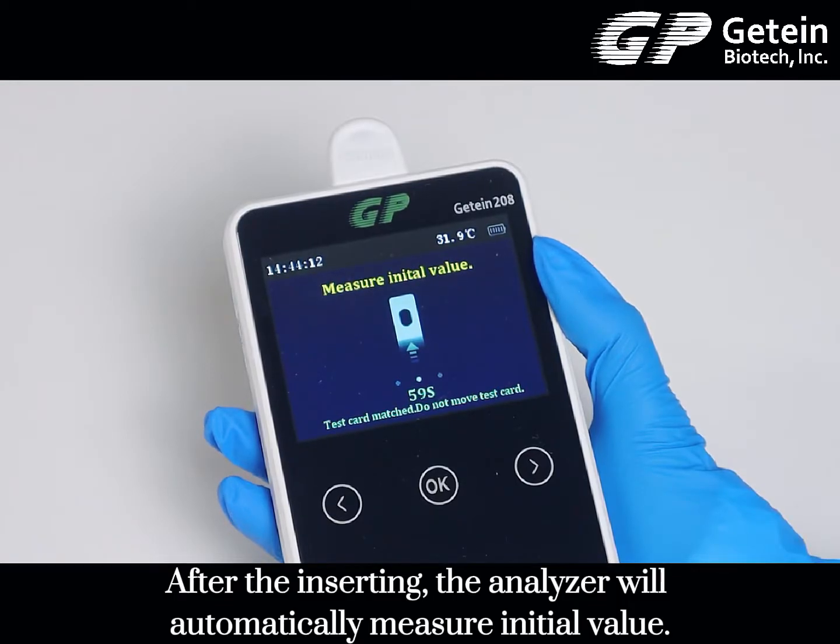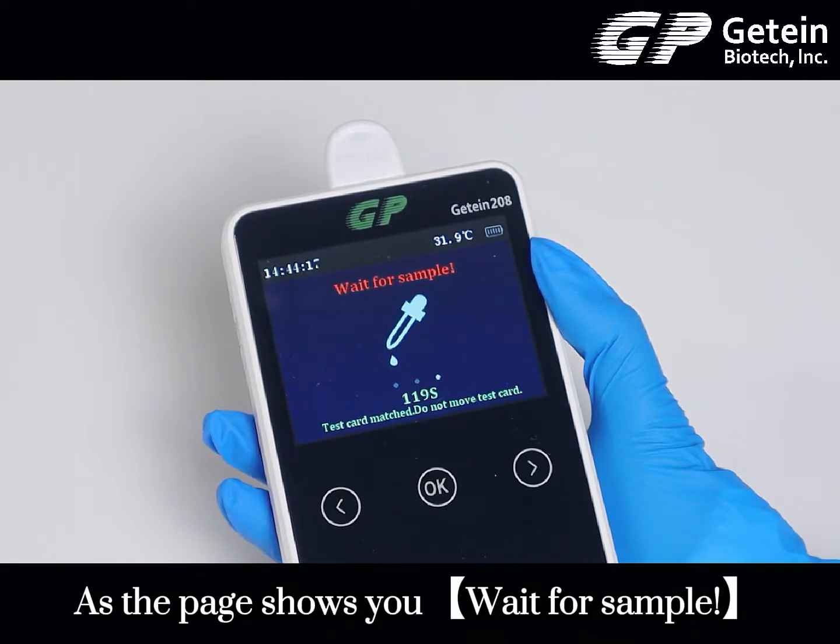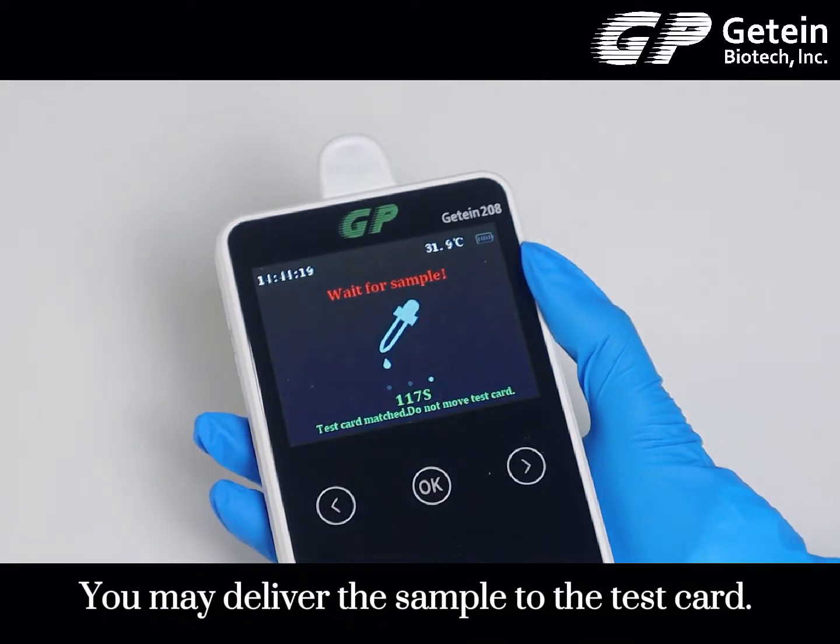After inserting the card, the analyzer will automatically measure the initial value. As the page shows, wait for sample. You may then deliver the sample to the test card.